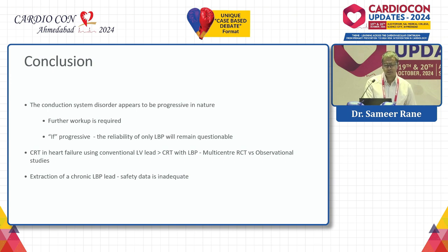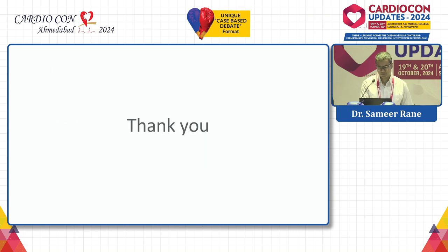Here the conduction system appears to be progressive in nature, and further workup is required to come to a conclusion. If it is progressive, then the reliability of left bundle pacing alone will be questionable. CRT in heart failure has a lot of evidence, multicenter randomized controlled trials versus observational studies. And for extraction of a chronic left bundle pacing lead, the safety data is inadequate. Thank you.